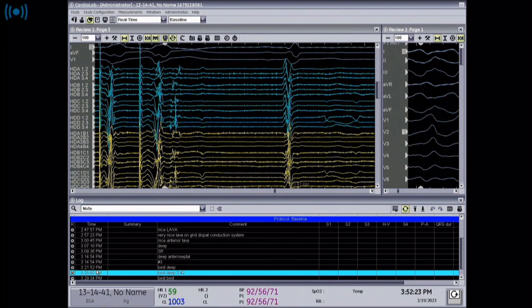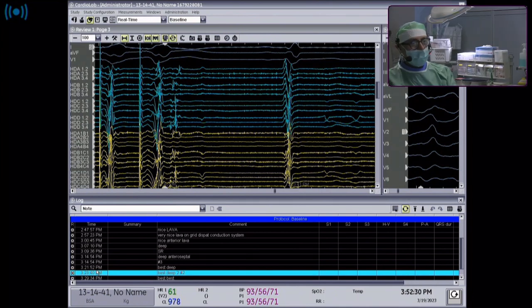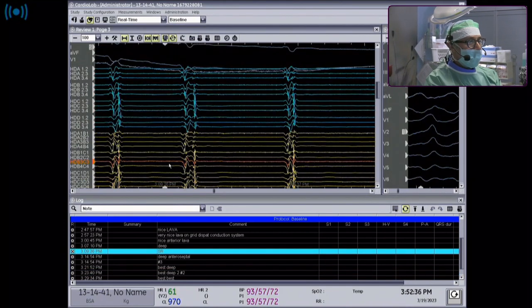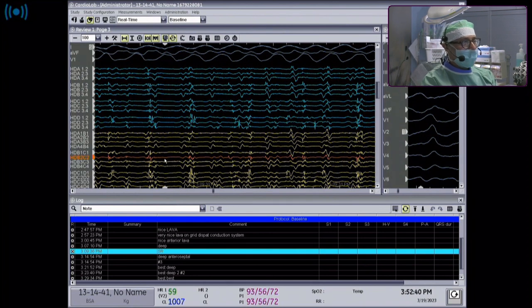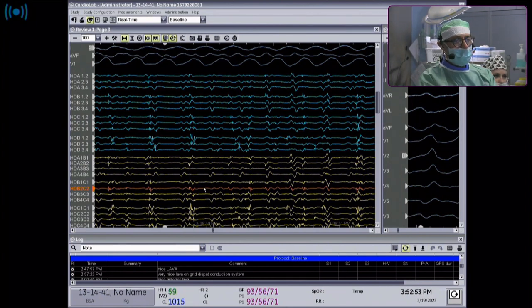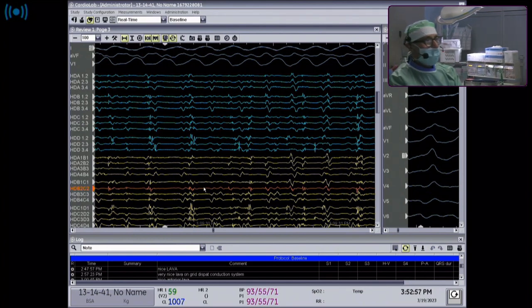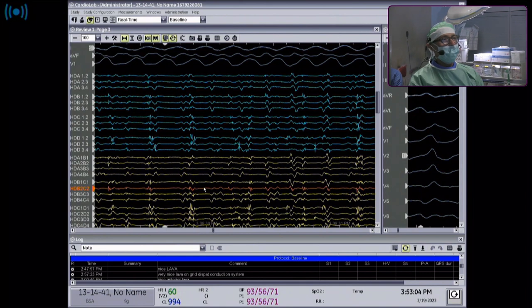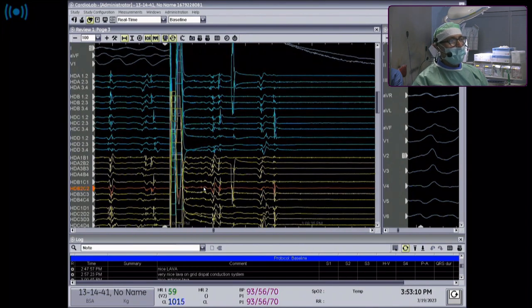We went on to induction of VT, which was not as monomorphic as the prior attempt - it quickly went into polymorphic clutter and we had to shock the patient within a few seconds, so no time really to achieve activation mapping. The initial strategy was to place the grid at the site of conduction delay during sinus rhythm, but we got nothing one-to-one and had to shock again. This is a case where activation mapping is impossible both for hemodynamic reasons and continuous changing of QRS morphology.